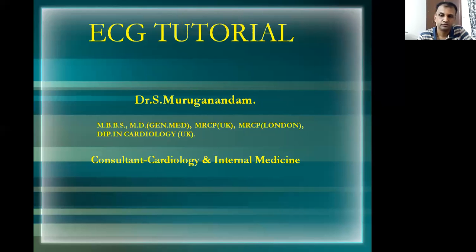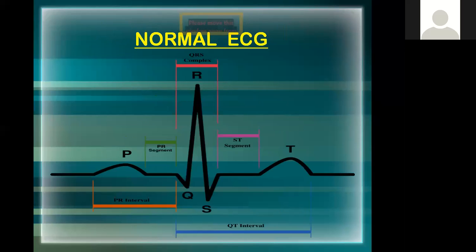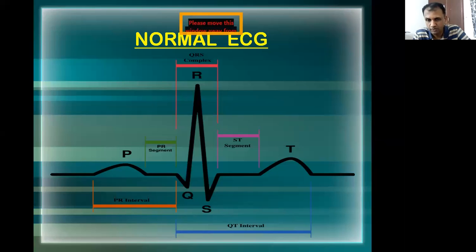Yes. So just to recap from last week, this is what the normal ECG looks like. If you remember, each P wave will be followed by a QRS and a T wave at the end. So without wasting much time, we can go on to the further slides.